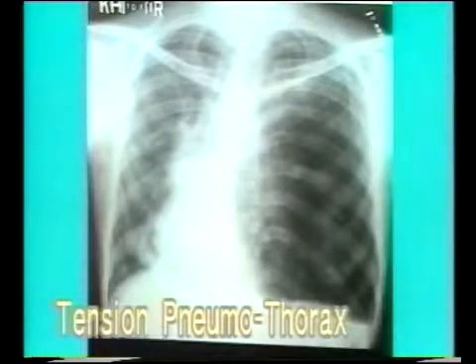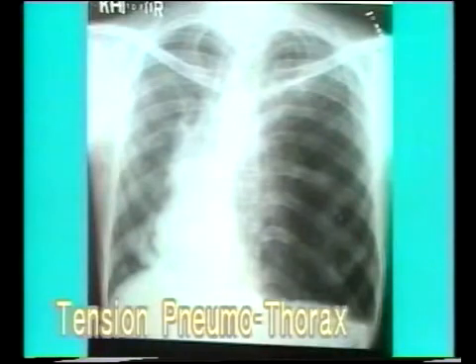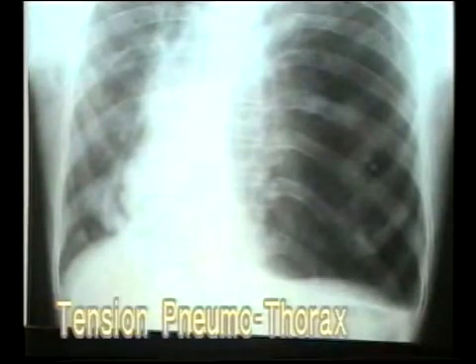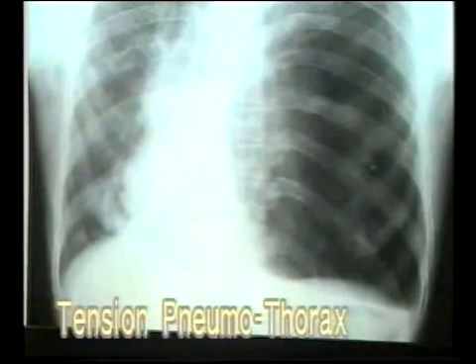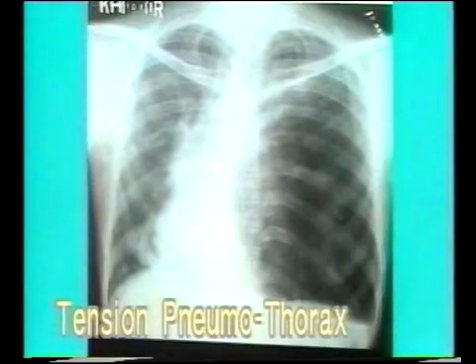This is another case of a complete pneumothorax. The left hemithorax is radiolucent and the mediastinum is markedly pushed to the opposite side compressing the right lung. The large amount of shift of mediastinum is indicative of the high pressure in the pneumothorax and this is termed as a tension pneumothorax. A tension pneumothorax is a medical emergency requiring urgent drainage as it is compressing the opposite lung and hampering with its expansion.